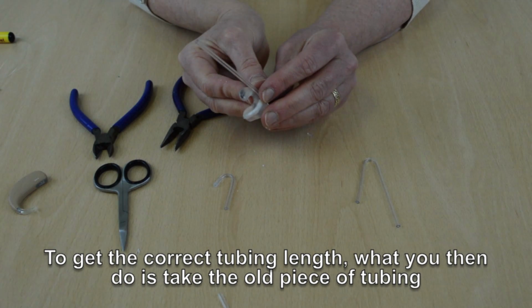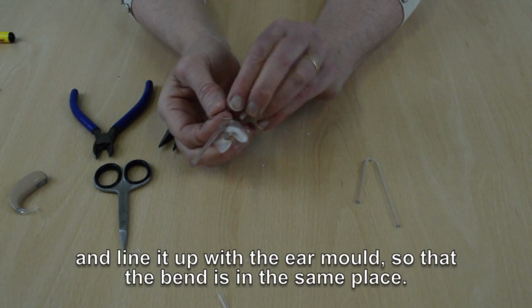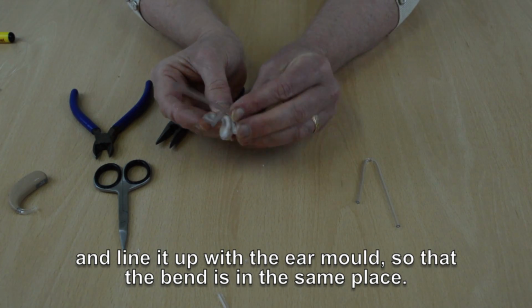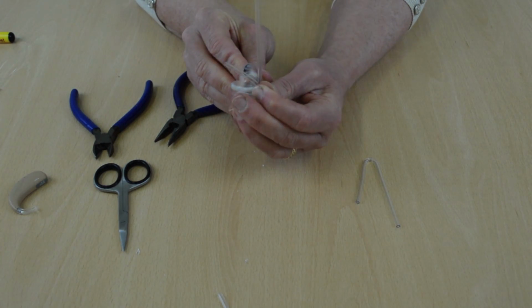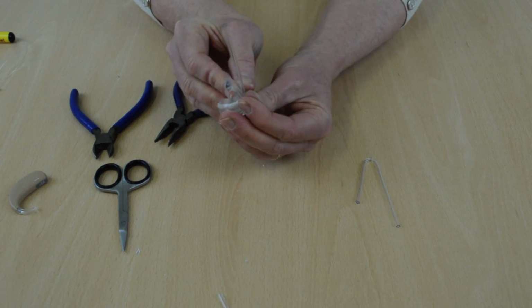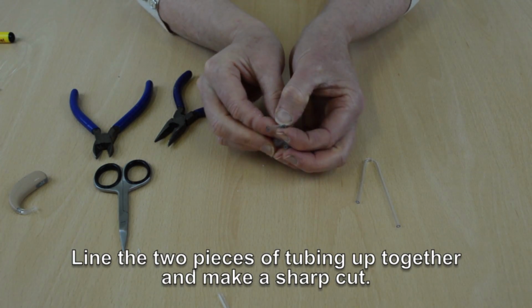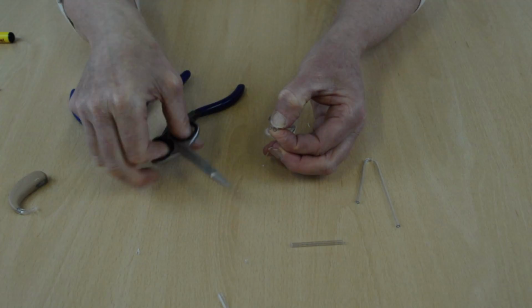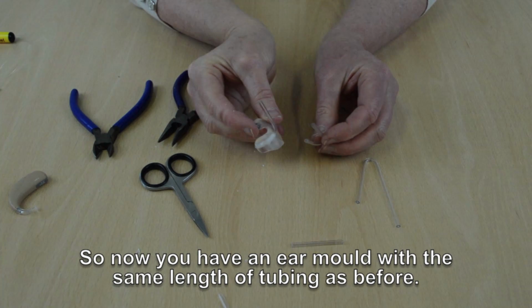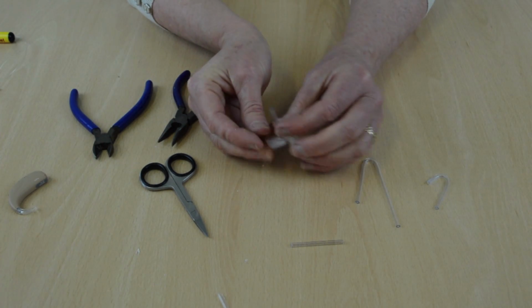To get the correct tubing length, you take the old piece of tubing and line it up with the ear mould so that the bend is at the same place. Line the two pieces of tubing up together and then make a sharp cut. So now you have the ear mould with the same length of tubing as before.